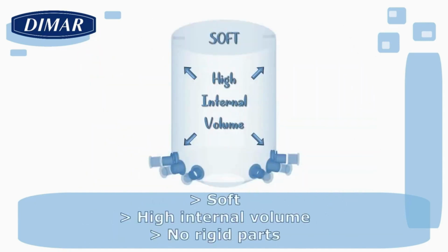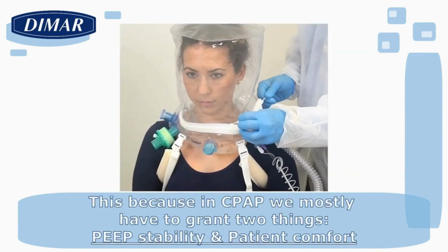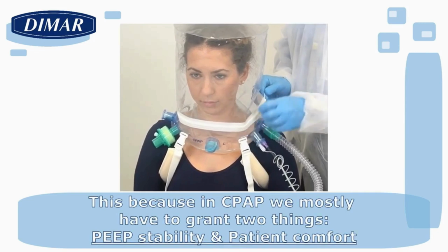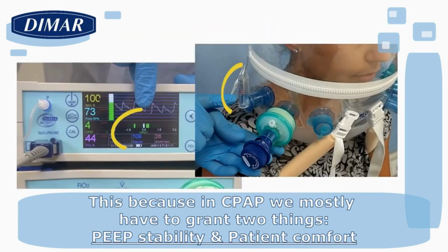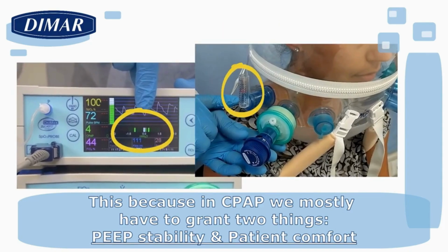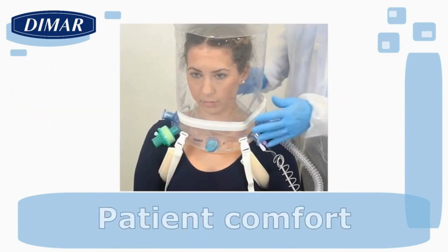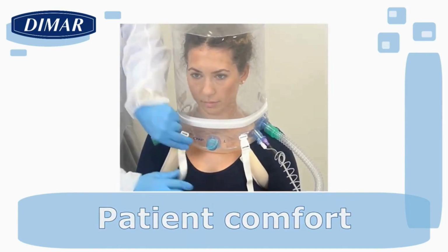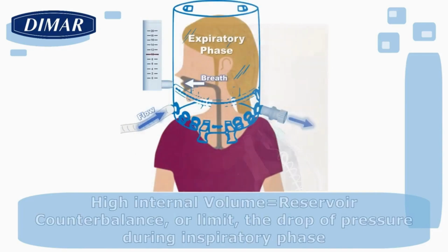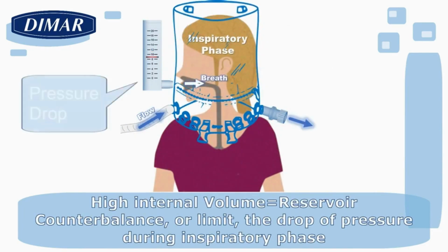CPAP helmets are soft with high internal volume and they don't have any rigid part. This is because in CPAP we mostly have to grant 2 things, PEEP stability and patient comfort. Softness and high internal volume are both preparatory to patient comfort, granted by the absence of any rigid component, and PEEP stability. The high internal volume works as a reservoir suitable to counterbalance, or limit, the drop of pressure during the patient inspiratory phase.